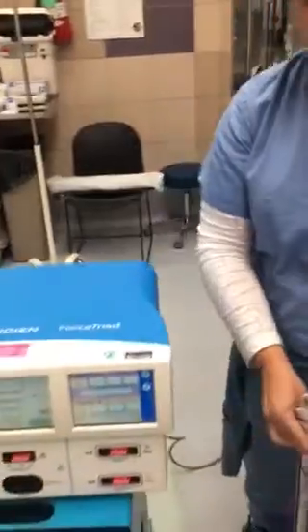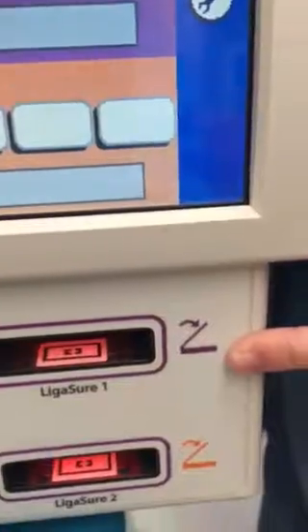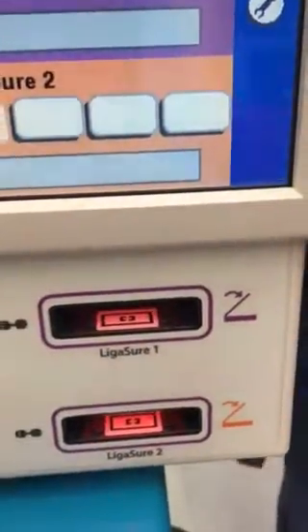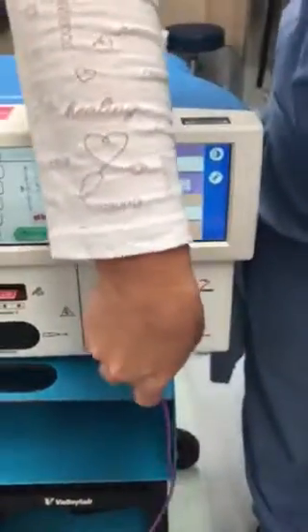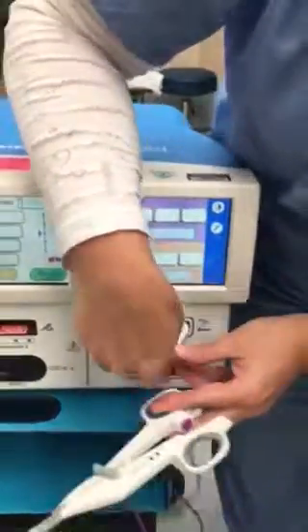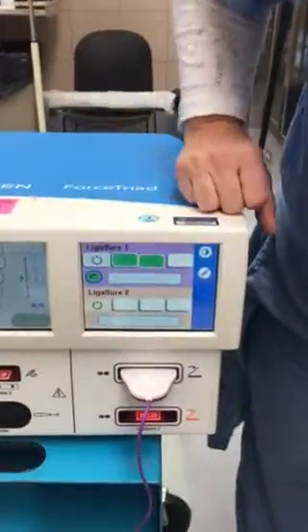When you look at the machine, there are 2 spots for Ligasure: Ligasure 1 and Ligasure 2. Notice Ligasure 1 is purple. That is exactly where we are going to plug this small Ligasure into. So I will plug it in, and notice when I do, you get green lights across the Ligasure 1.